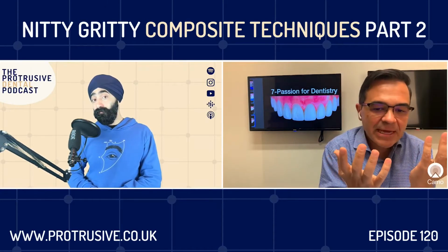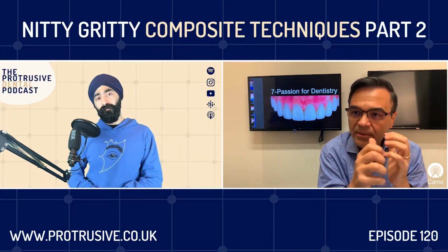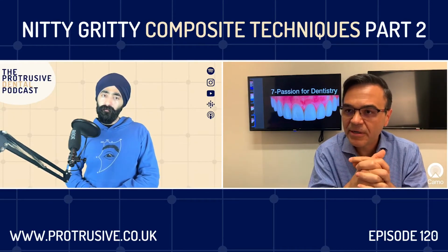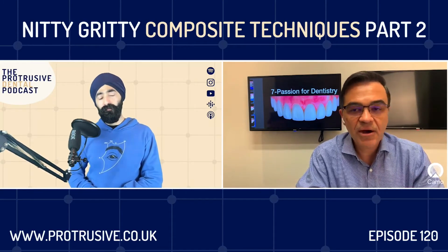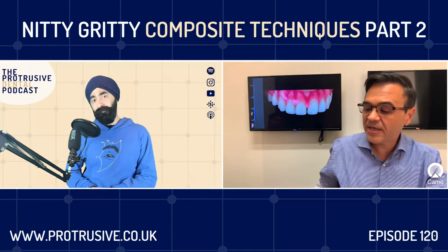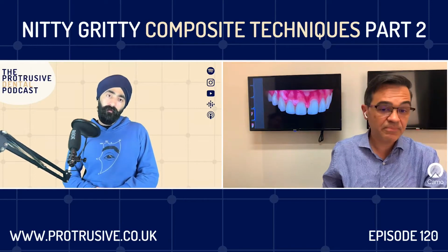And that's something that I found out that is very hard to control. Nowadays, with the new points and cups that you have for polishing zirconia and Emax, you can get better polished ceramic than before, but it's still harder to do than when you do composite. You're relying a lot on the lab again, basically. Composite is by far easier to polish than porcelain.